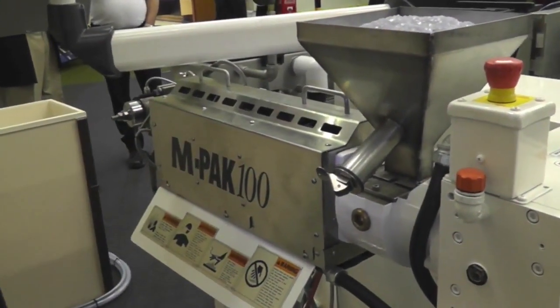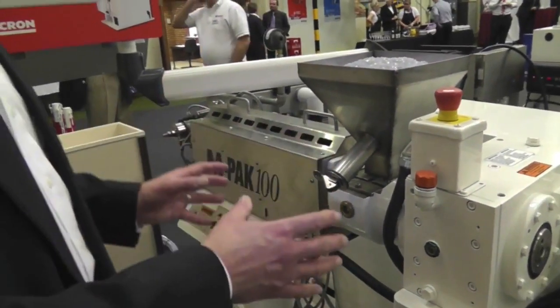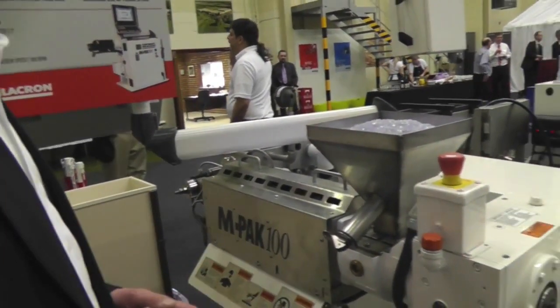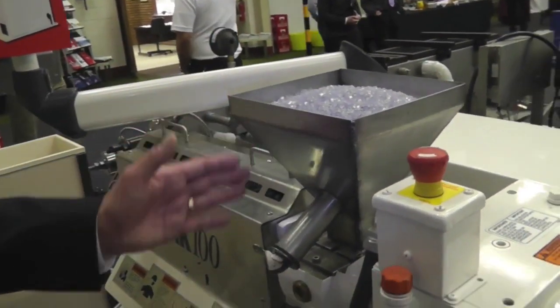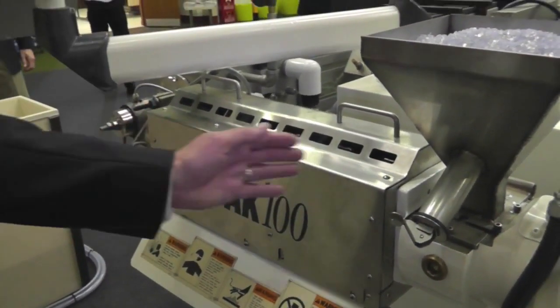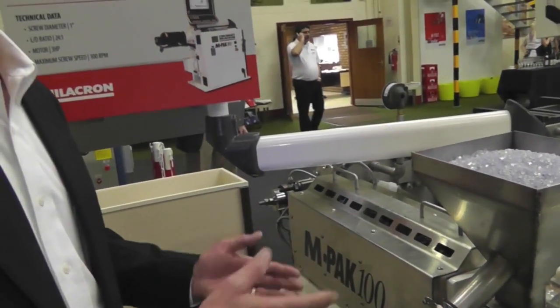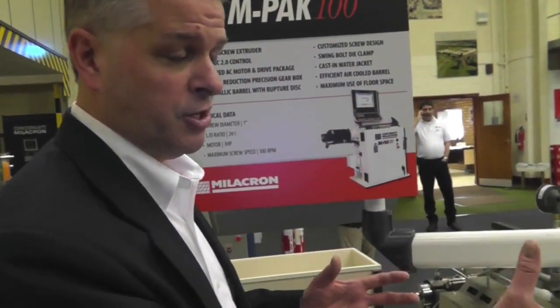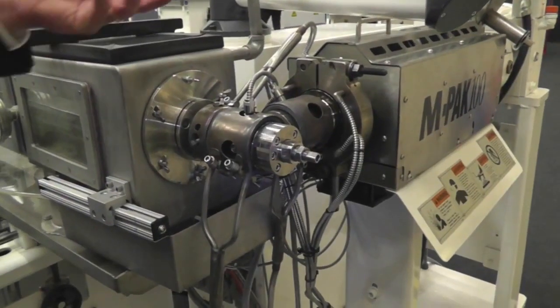The machine is set up for medical applications — stainless steel covers and metallurgy configured for clean room use. We take the polymer in solid form and plasticize it through the machine. Inside we have a screw with geometry suitable for the material; we match the screw design to the material. If a different material were used, the screw geometry would change accordingly. We go from a solid to a melt phase.